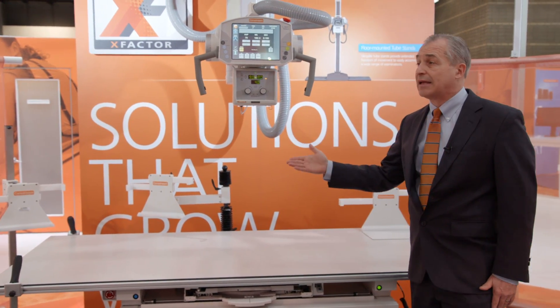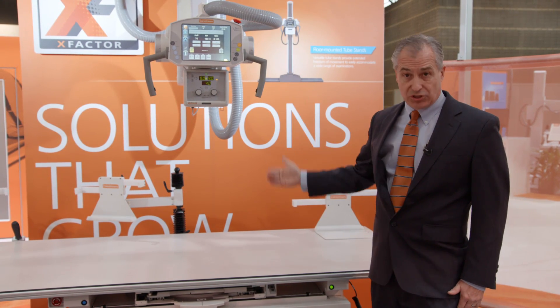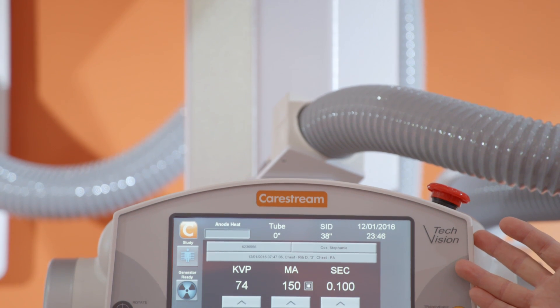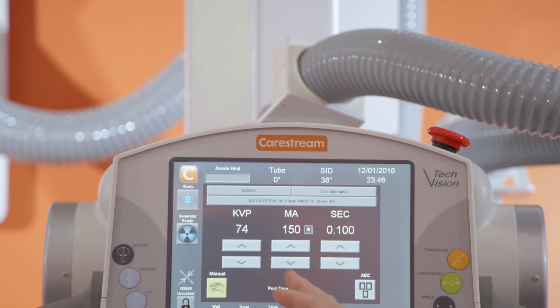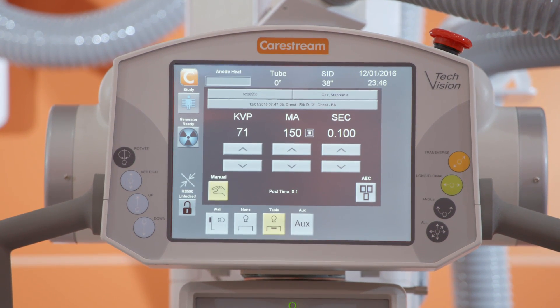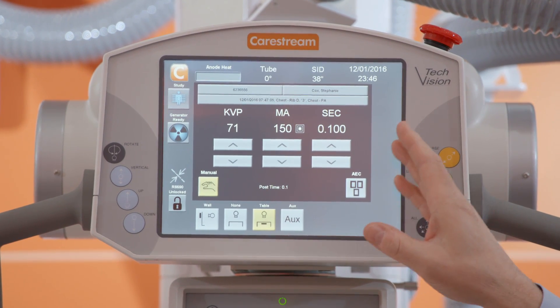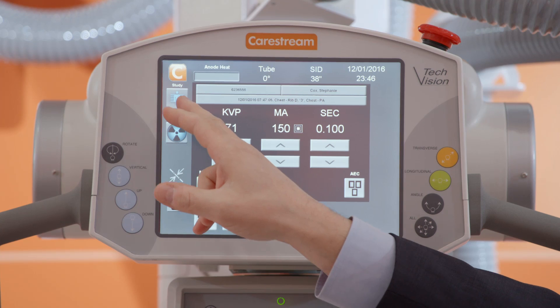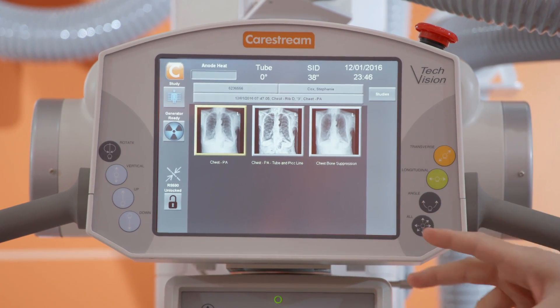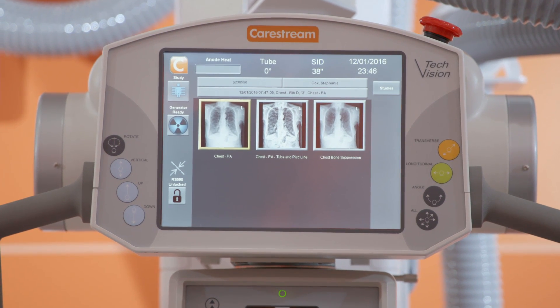We also have tracking on the wall stand, so if the wall stand moves, the tube will track with it. This model shows our Tech Vision feature, which gives you the ability to control the generator from the tube head just as you would on the console. That gives you KVP, MA, and time capability, as well as the ability to view images and select exam types before you take your shot, so that you can be with the patient.